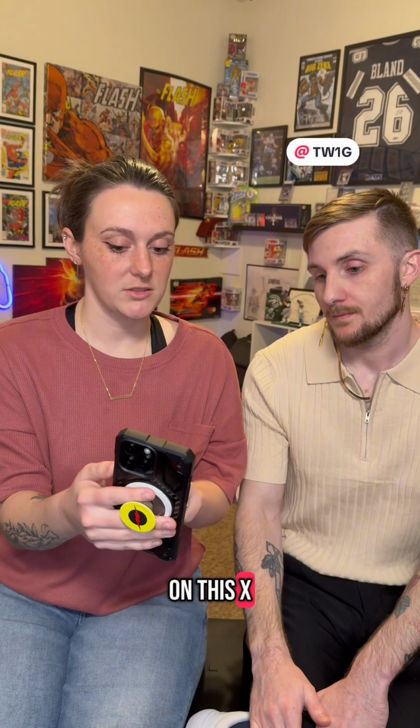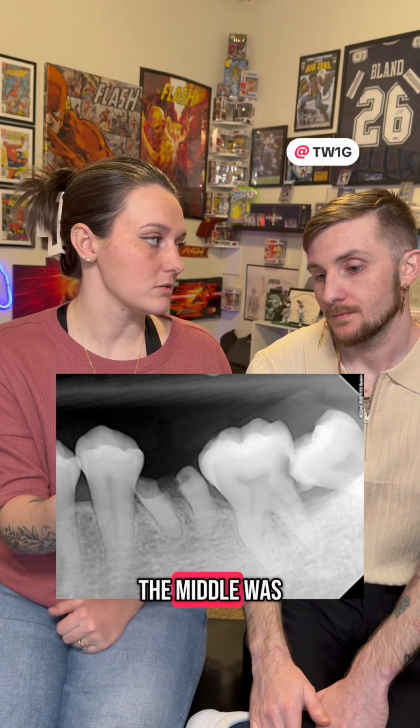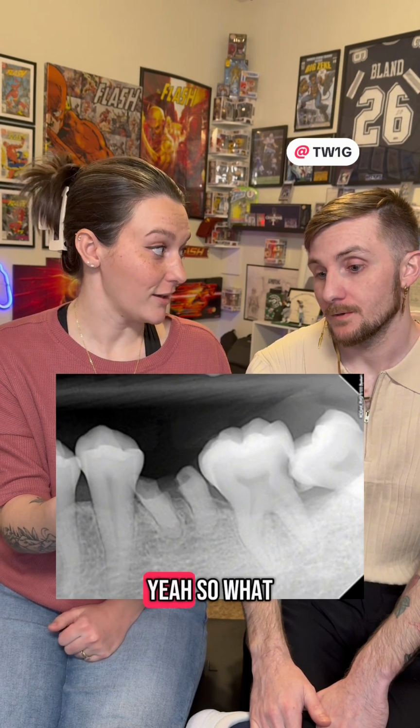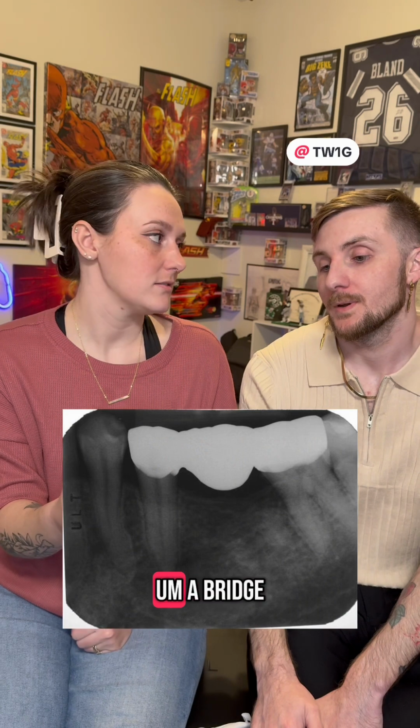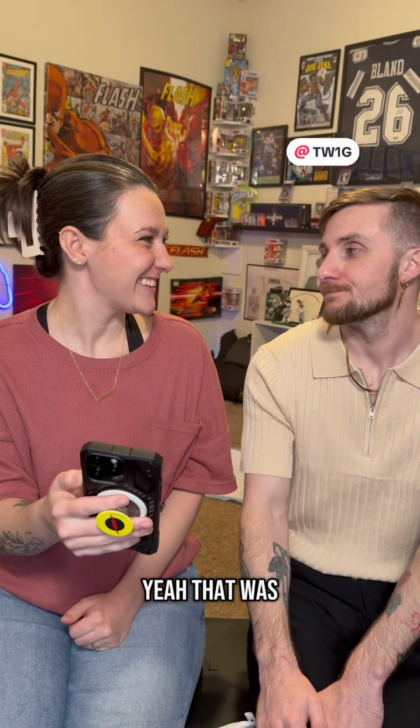So on this x-ray, what is this right in the middle? Those are roots. Right? Yeah, so what would that be called? The root tip. Yeah. In this x-ray, what is that? A bridge. Yeah, that was easy.